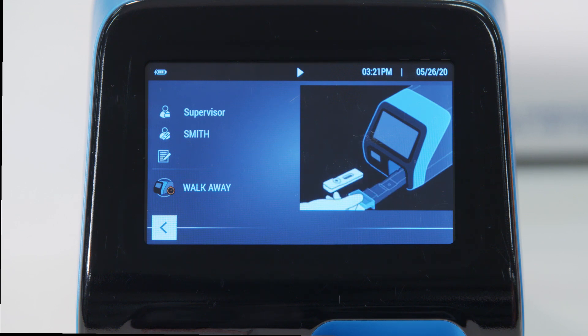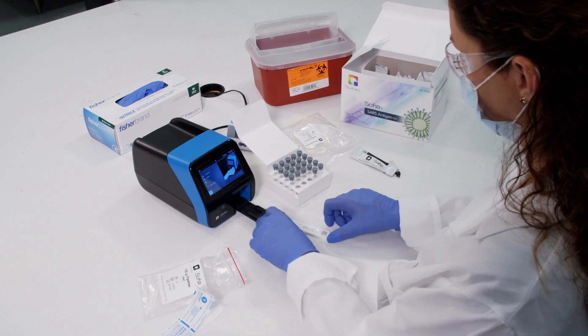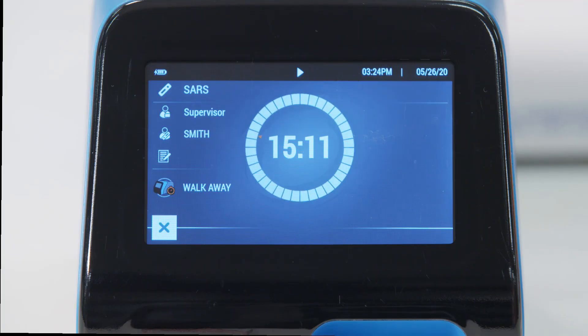The user will then see an on-screen animation instructing them to open the cassette drawer and insert the patient sample. Once the drawer is closed, timing will begin automatically. When in walk-away mode, SOFIA2 will scan the patient cassette during the 15-minute incubation period.